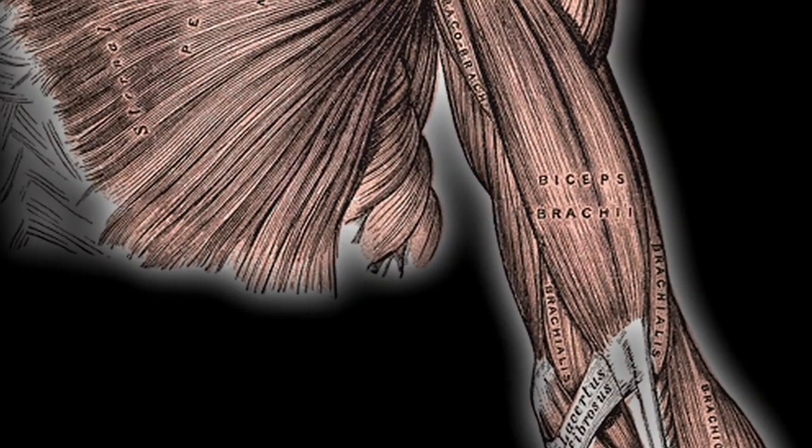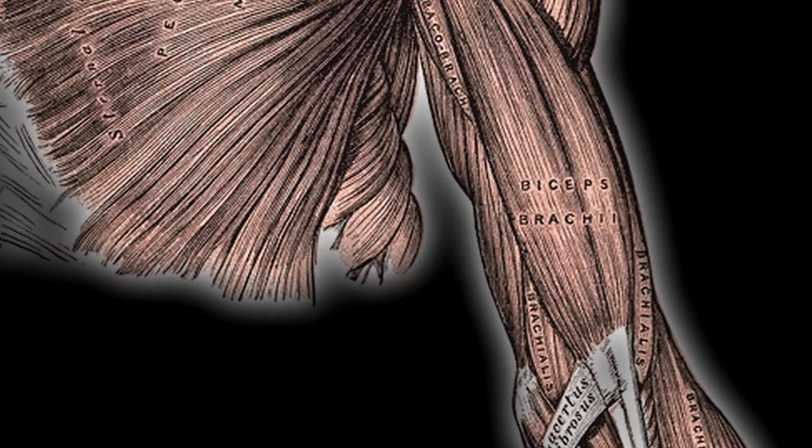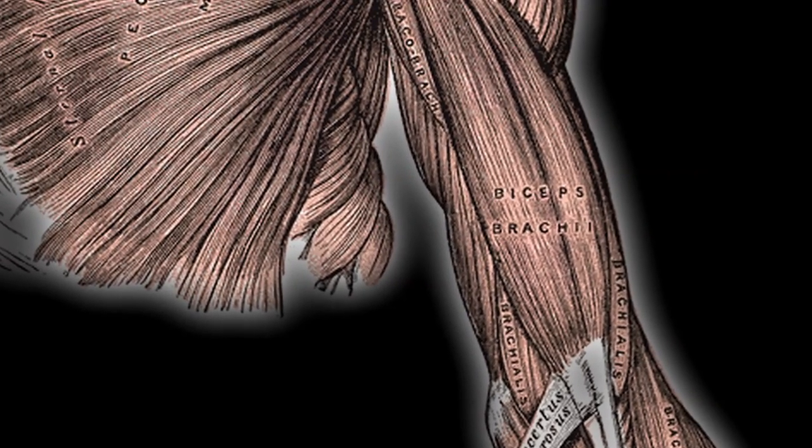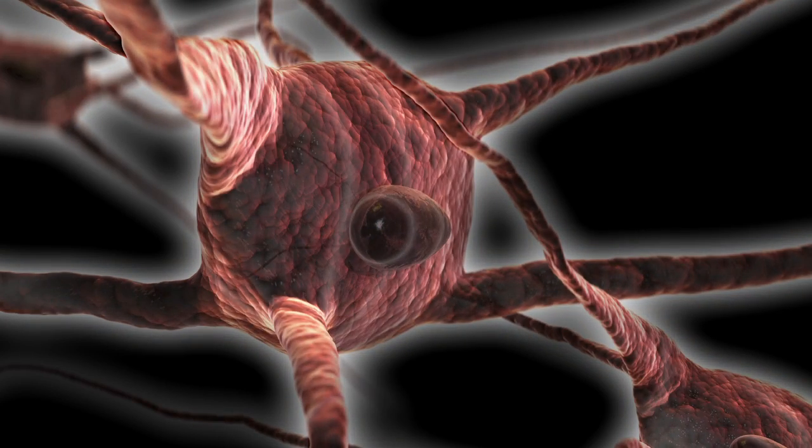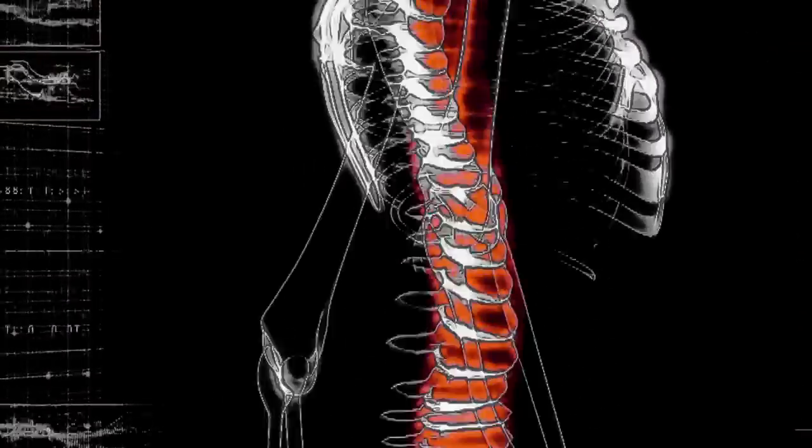Ahmed will talk more about our research. Focusing on the electrical aspect of our device, what we are doing is using EMG signals to stimulate weakened muscles. Weakened muscles can come from either neural disorders and diseases or even muscular diseases and disorders.